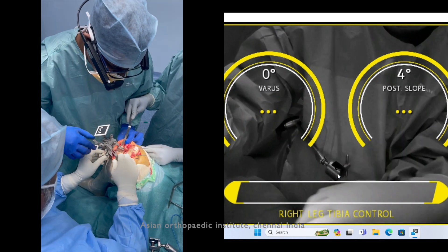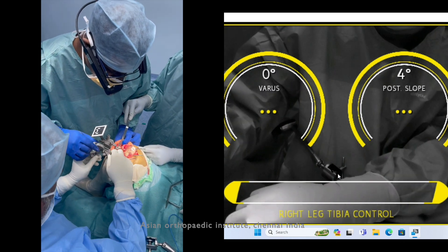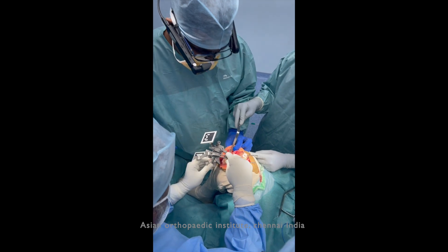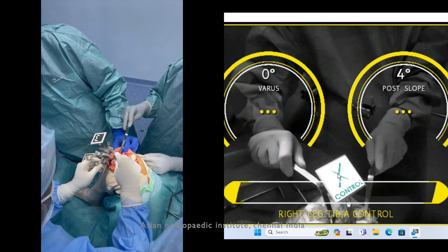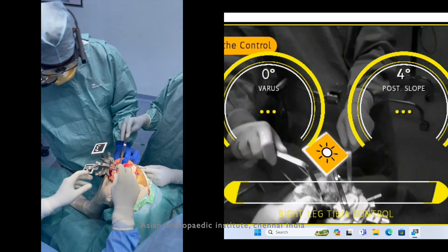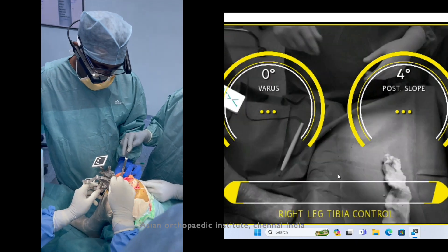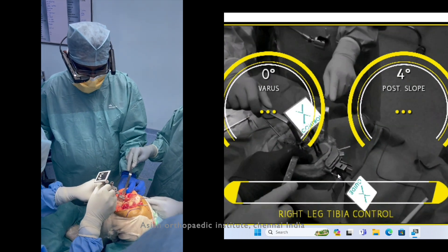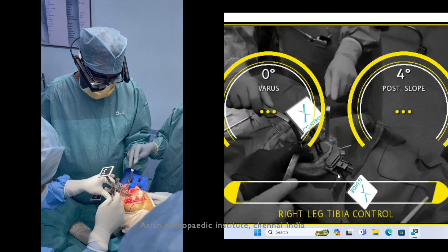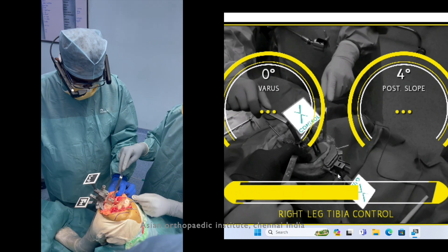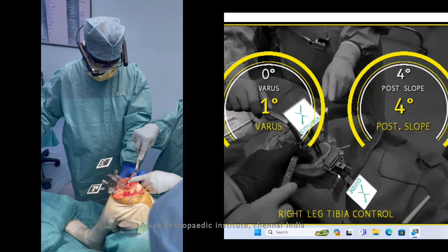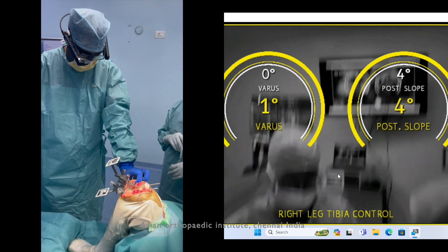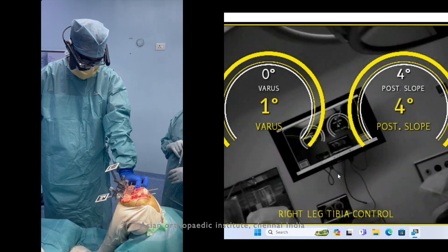This guide gives you varus/valgus and anterior and posterior slope. Counter-check with the bone resection stylus to verify the amount of bone required to be removed.